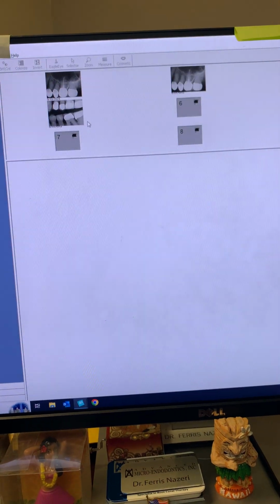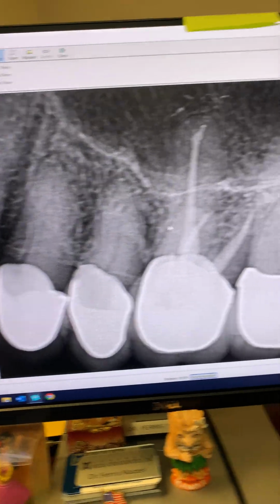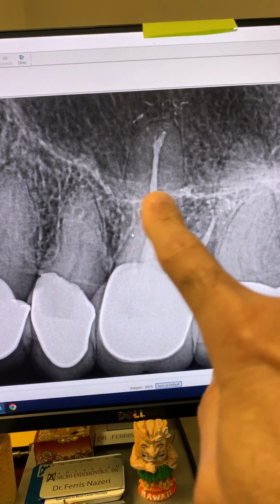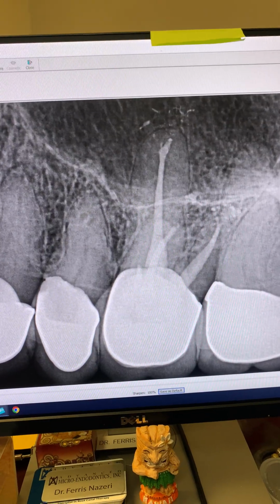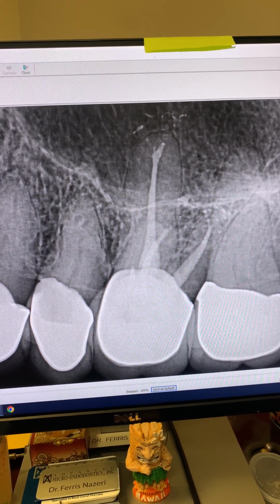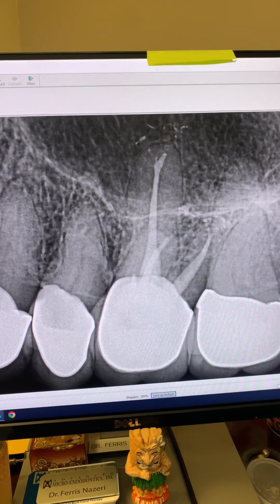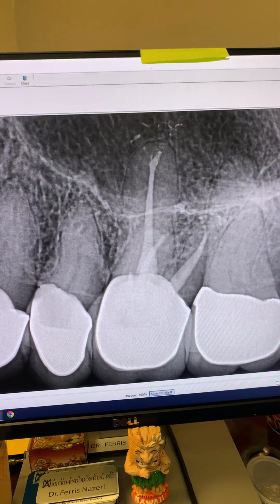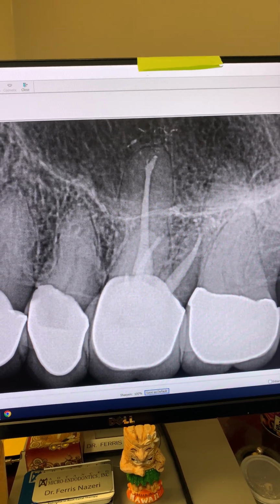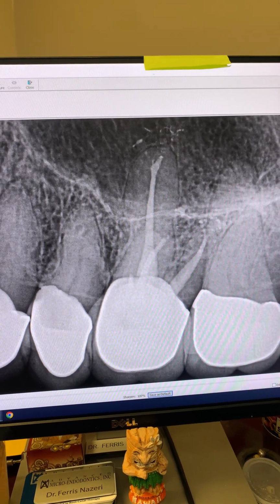And take a look here. She still has the tooth. The periapical lucency is healed completely. She has zero symptoms. I told her, you came and saw me 11 years ago when you were 83 years old for tooth number 14 for me to redo it. She couldn't even remember. She's like, I was here? You worked on a tooth for me? I said, yes, 11 years ago.